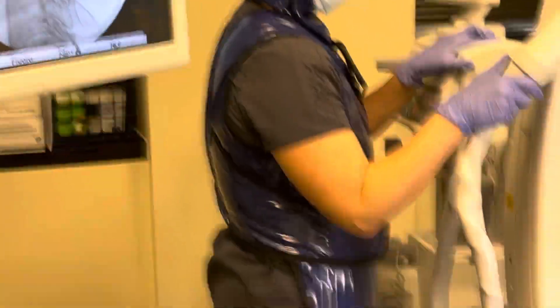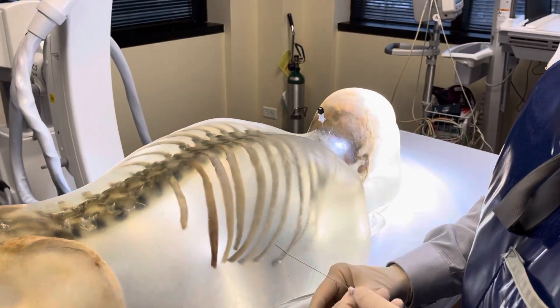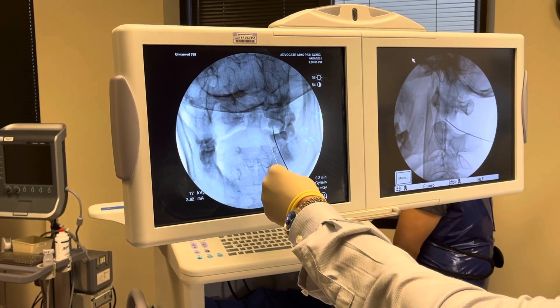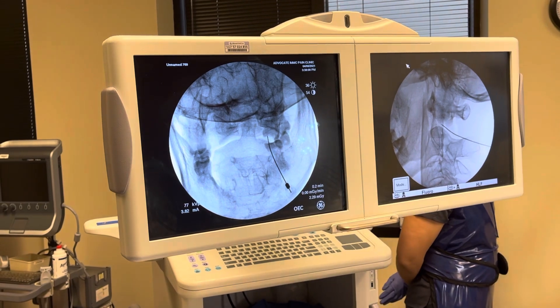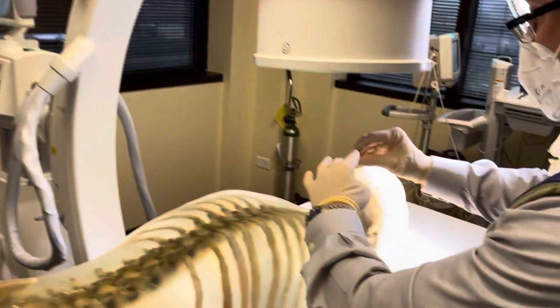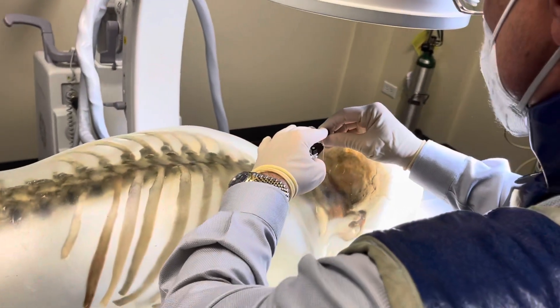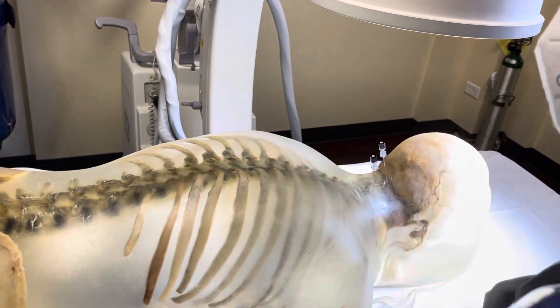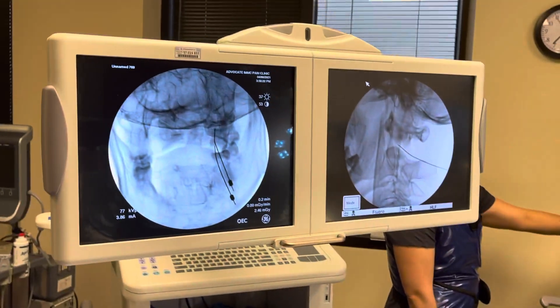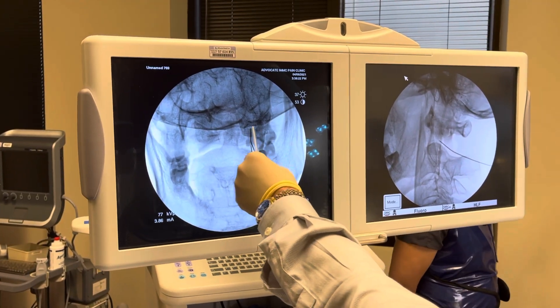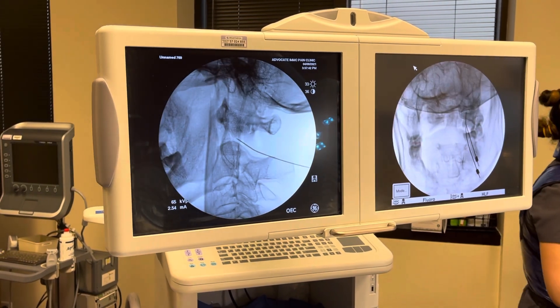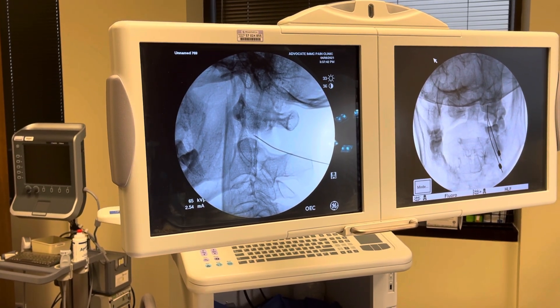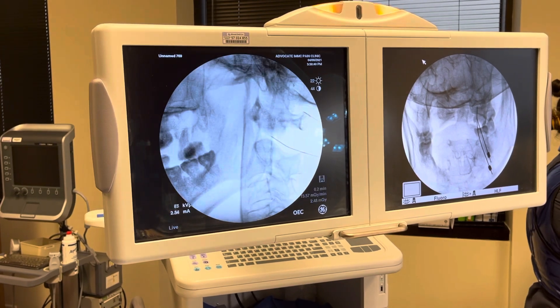Next, in tandem, I'm going to proceed with the atlanto-occipital or C0-C1 joint injection. There's my needle situated in the center of the atlanto-axial joint, and now I'm going for the next joint at the base of the skull — the atlanto-occipital joint. I start out again in the posterior to anterior orientation, not advancing more than about a centimeter and a half. I'm directly in the central portion of the atlanto-occipital joint on the right side. On the lateral view, the target and goal is again to avoid trespass of the vertebral artery, and by staying in the central portion of this space, I have hopefully accomplished that.